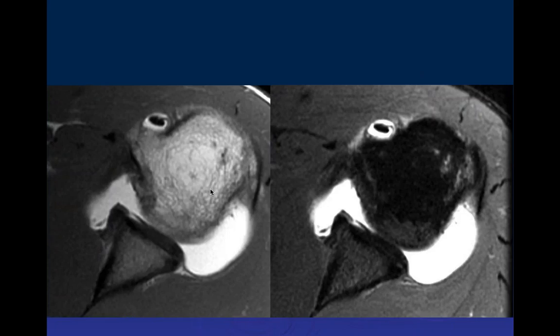Okay. Shall I? Yeah, axial T1 and PD fat set images in a patient who's had an arthrogram. And the anterior labrum looks blunted, and maybe there's some cartilage defect as well, anterior glenoid. And there's some low signal intensity loose body anterior to the glenoid. Yes, sometimes you just get stranding in these patients. You would have to look up and down to see whether it communicates with the synovium or not.